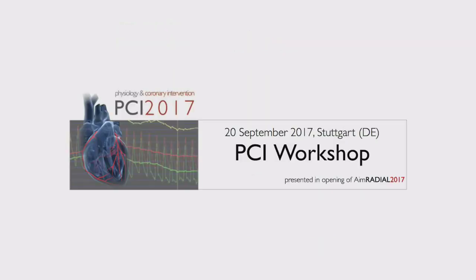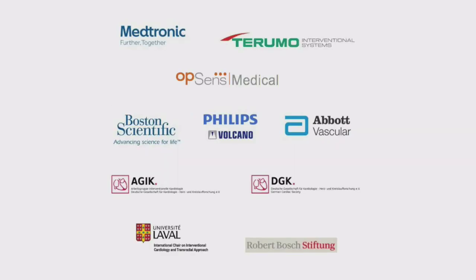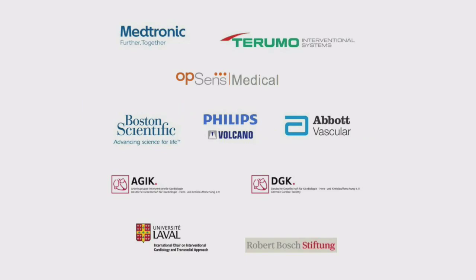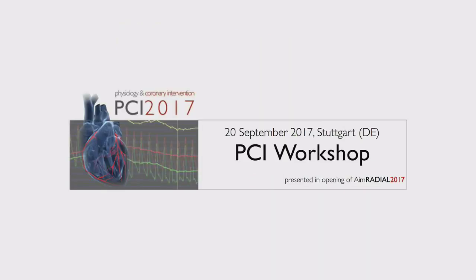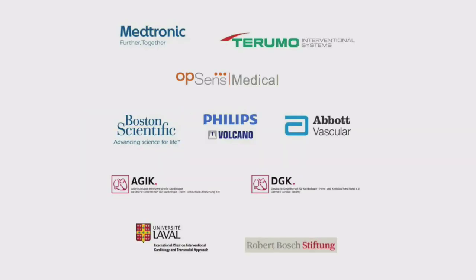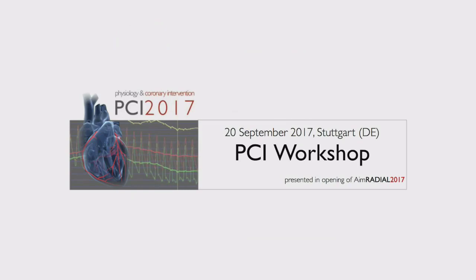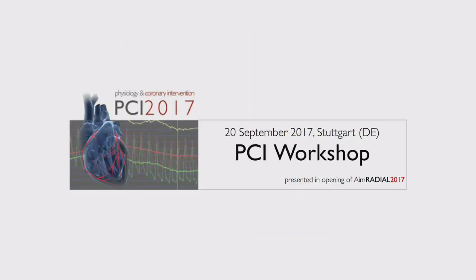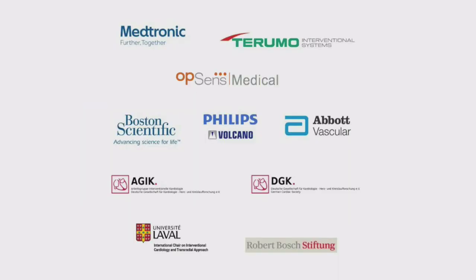In my view at this stage, I would encourage people to report and publish more of their own experience, because we can be very enthusiastic doing post-PCI FFR, especially using the new wires. But sometimes you get completely discouraged. I remember I did one in-stent restenosis for a diagonal, and I was measuring afterwards, and I ended up finally in the LAD, and then I spent like 1 hour, and I thought it was done. So the mindset and the burden of doing more is something very difficult. I think that just by having more people trying to understand, it's a very nice field, and I'm sure we will come up with something, but the burden is huge, in my view.